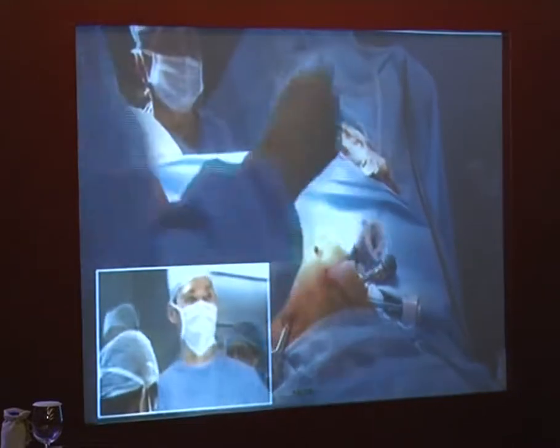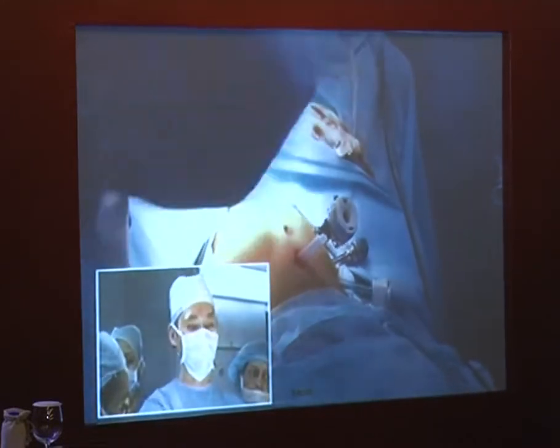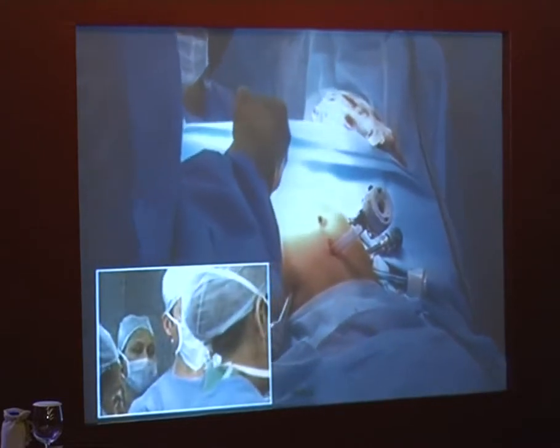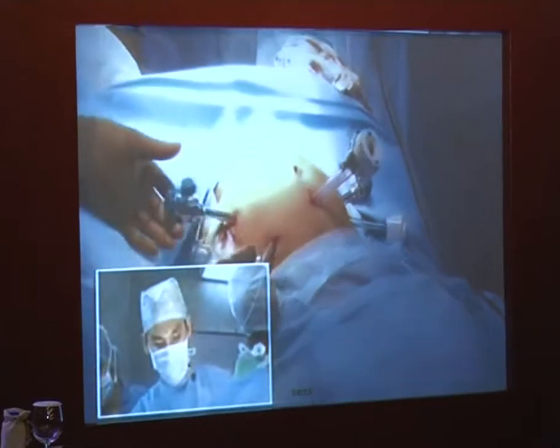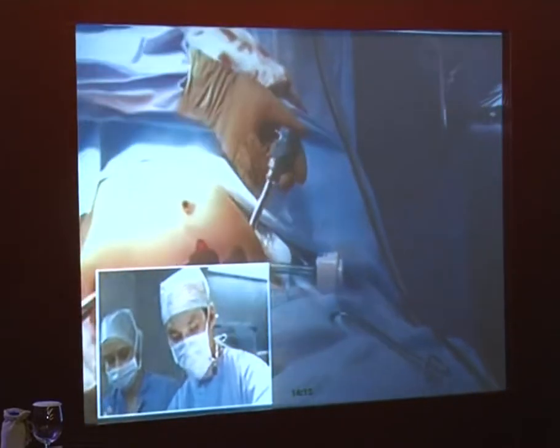Give me one more. I anticipate we'll need about two running V-Loc barbed sutures to close the defect. So I'm preloading again. A reason for doing that is I have a 5mm accessory. You can't drop these needles in through the 5 without bending them, and I don't like to bend them. So we'll drop them ahead of time.